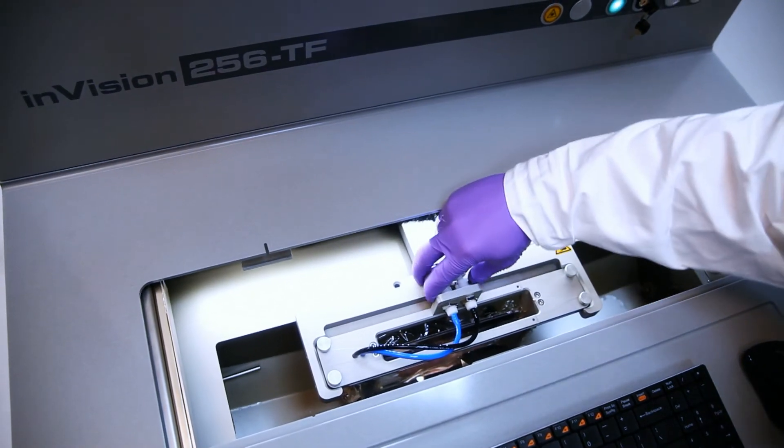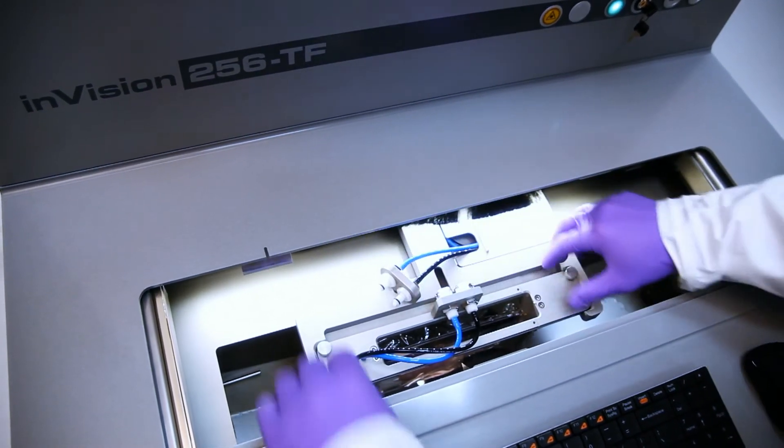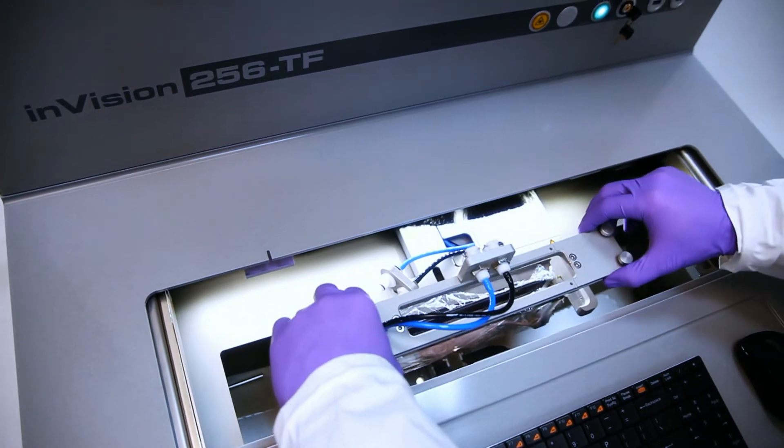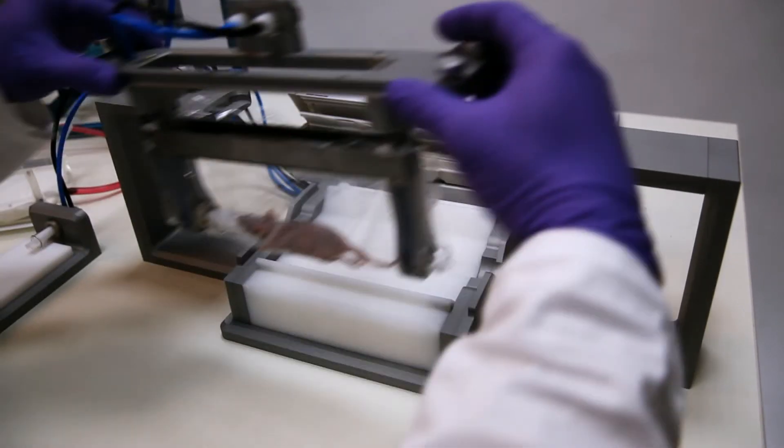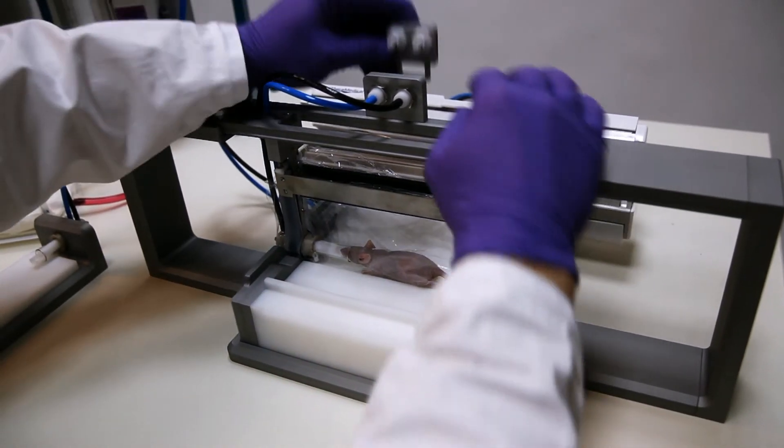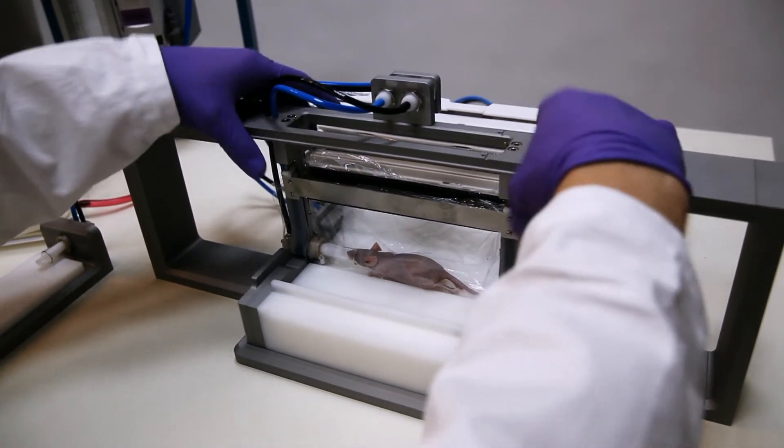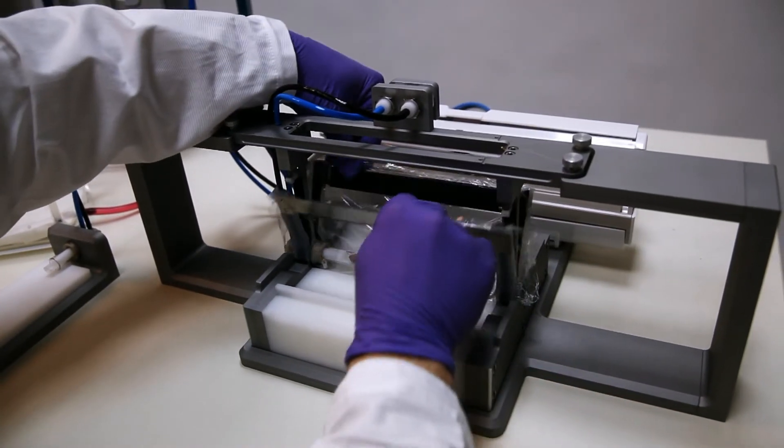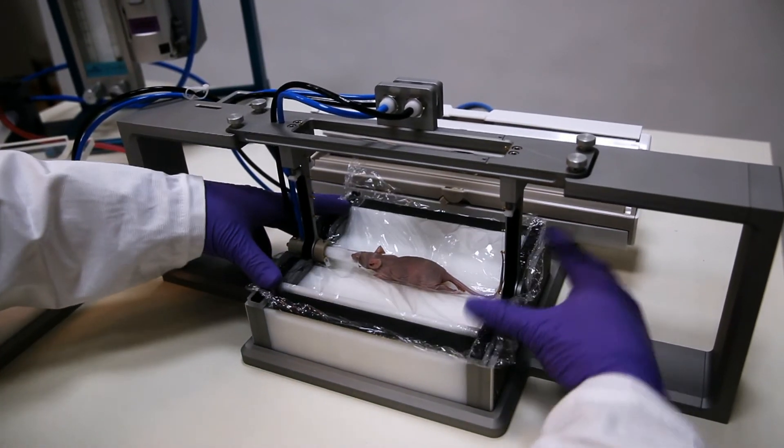After completing image acquisition, anesthesia is disconnected. The animal holder is removed from the system and returned to the preparation station.